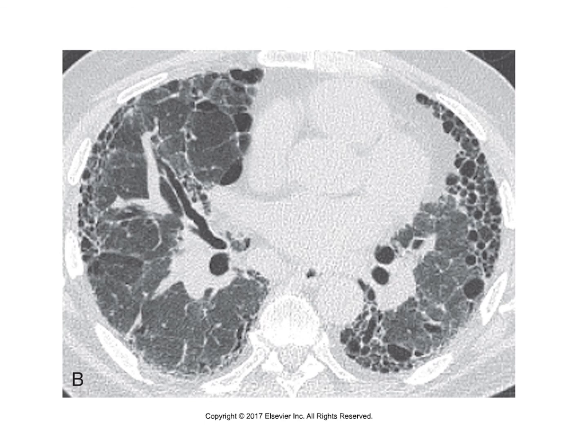Here is the CT showing honeycombing on end stage. So honeycombing being all this stuff in here. It looks like a honeycomb. Have some over on this side too. More so it looks like on that left side.